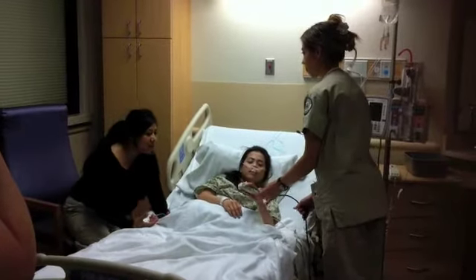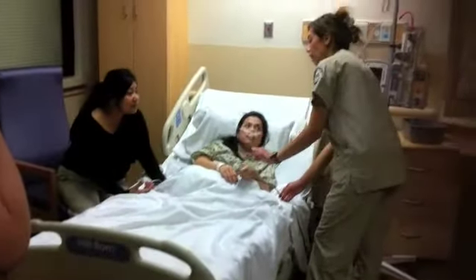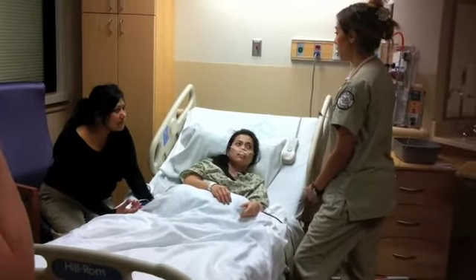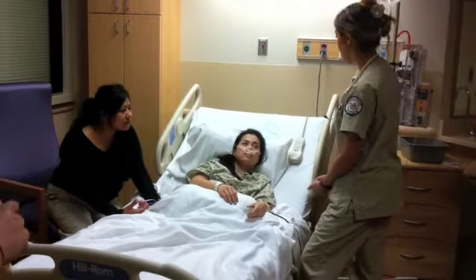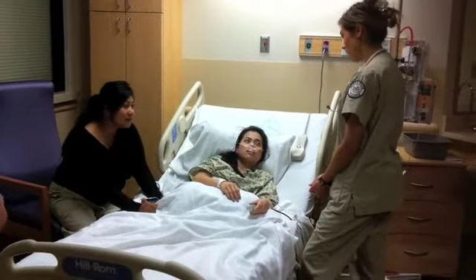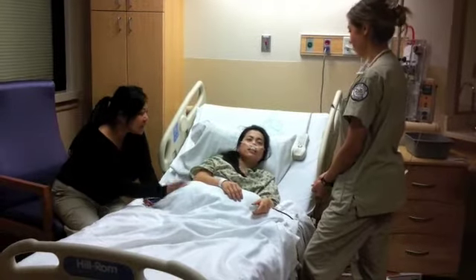When can I push it? When the light lights up, you can push it. That means that you can have an additional dose. But we don't want you to overdose, so it'll lock you out after a certain amount of time. Can I push it further? No, just the patient can do it. You understand that, baby? Yes.